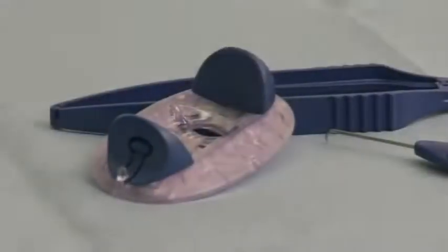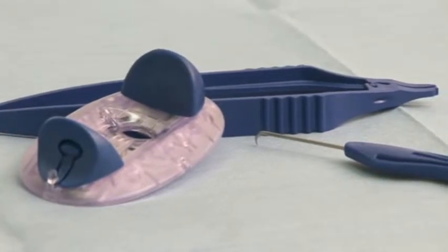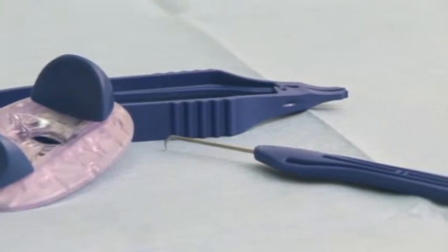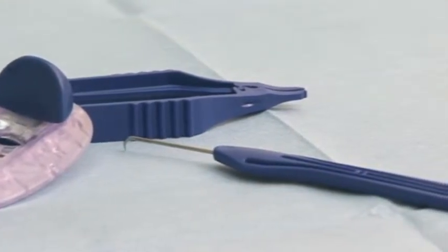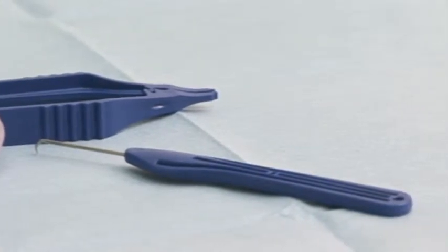The revolutionary ExeClip is the first and only instrument that simultaneously excises a skin lesion and provides a biopsy specimen for pathologic examination while providing a virtually suture-less closure of the surgical wound with a unique stainless steel skin clip.